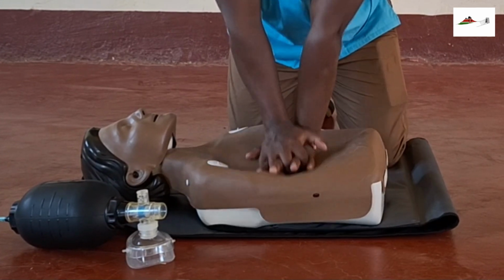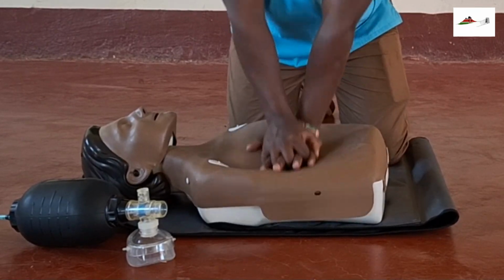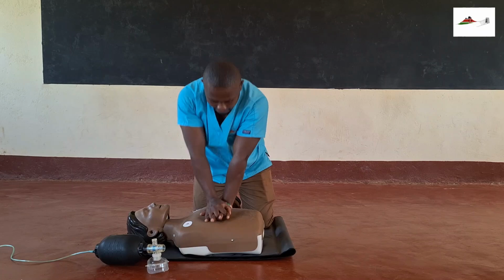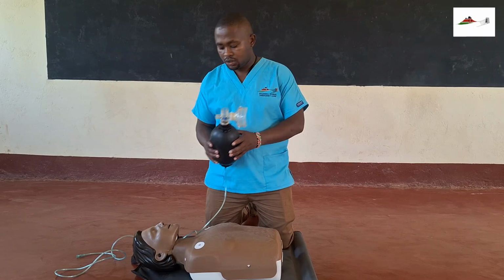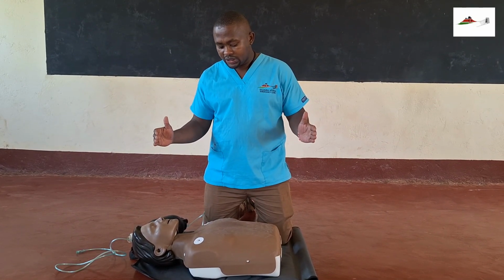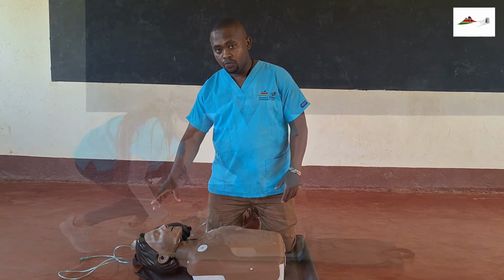Maintaining the rate. You need to do it now at a ratio of 30 compressions to 2 breaths.